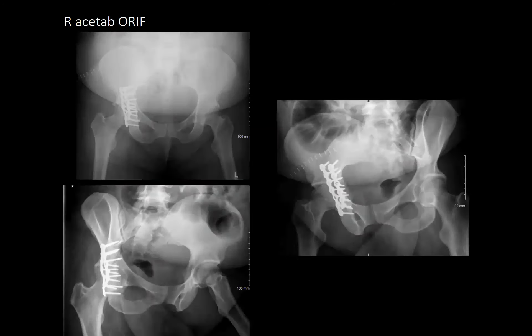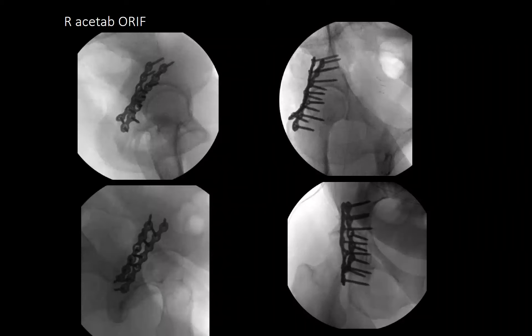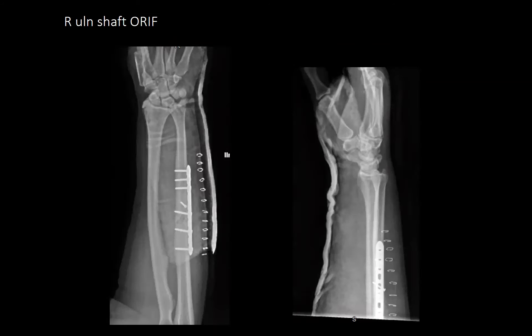Discussion about why only two screws proximal to the fracture: intraoperatively, it was felt the third-from-proximal screw had adequate bite. Ideally there would be one more screw proximally. Two-seven screws were used on the ulna — the 3.5 plate would be too large for this patient. With a good lag screw through the plate, the additional screw may not be necessary.